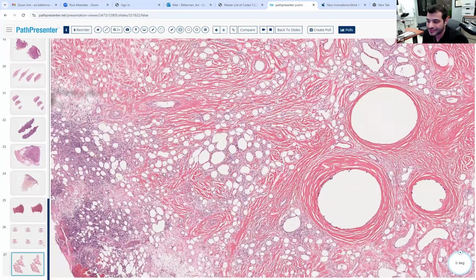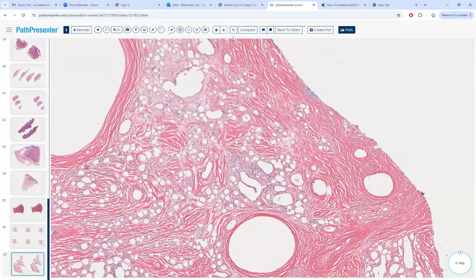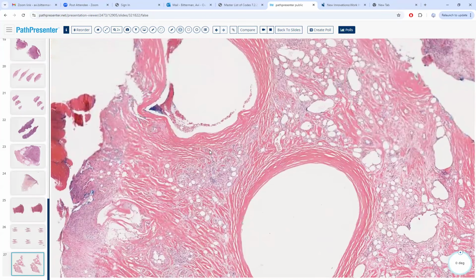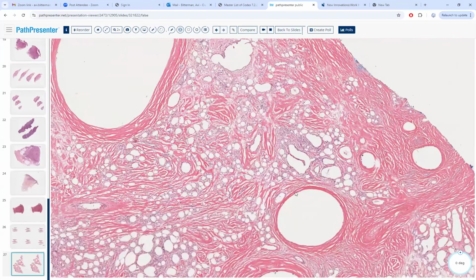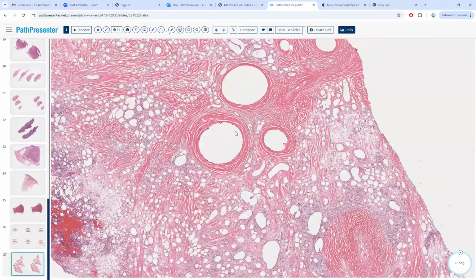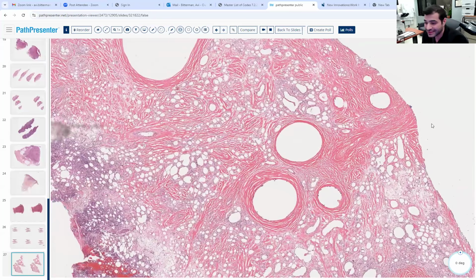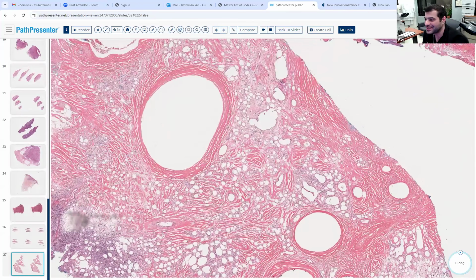But silicone typically has that champagne bubble look, right? You'll see that in the lip. Usually when there are those larger holes, there's some kind of contaminant that's not medical grade. It's like Home Depot or something. Back alley in the Bronx. So this is that typical example that they'll give you.